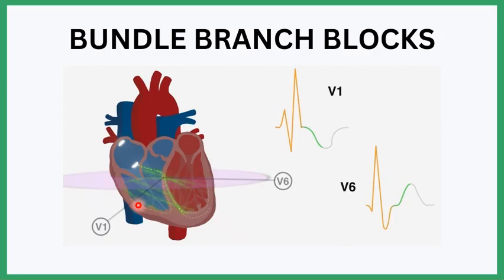So the very last part of this process is where impulses are moving from left to right to cover that right side. So once again, looking at it from V1's perspective, we see all the impulses moving from left to right to catch that right side, cell to cell transfer of electricity. So we have that second rabbit ear, which we call the R prime wave.